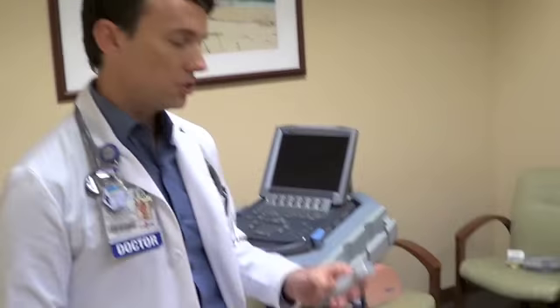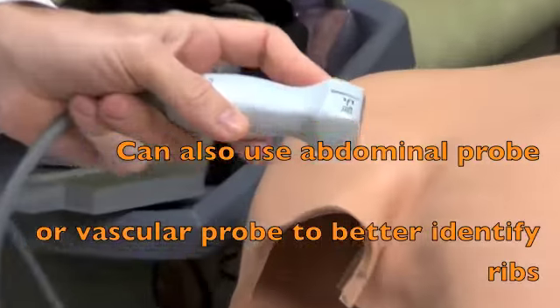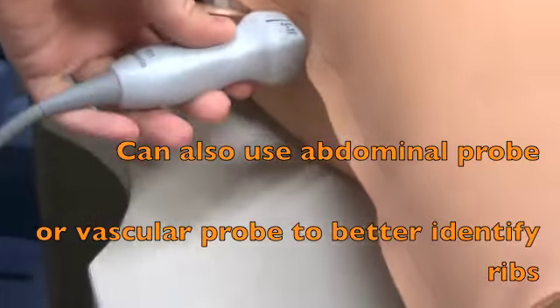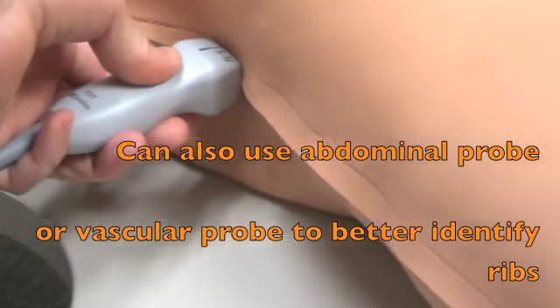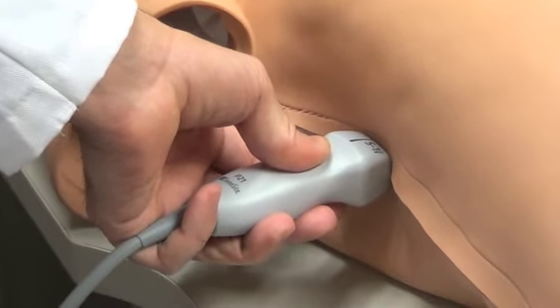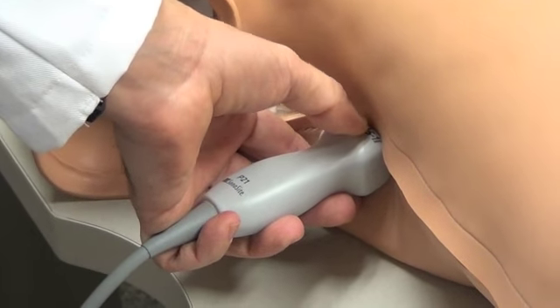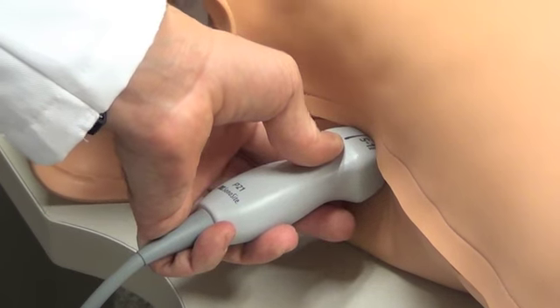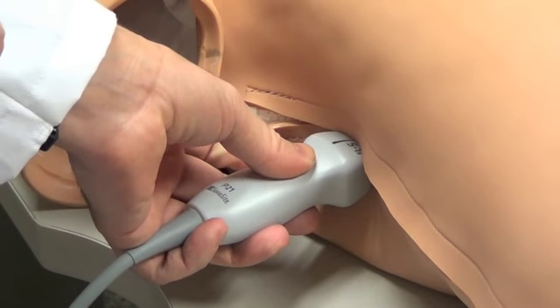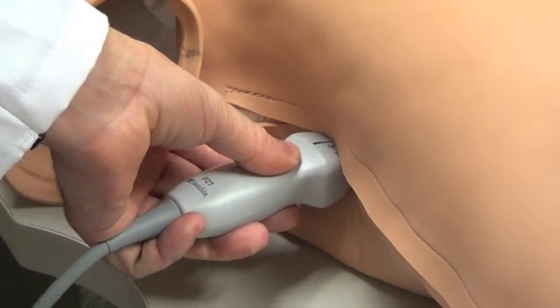Now we're going to talk about the procedure itself. The patient is in the supine position. I'm going to use the cardiac probe with the marker oriented cephalad, or superior. I've already identified the best, most optimal pocket by ultrasonography and confirmed it right where I would actually place my mark if I were marking this mannequin.